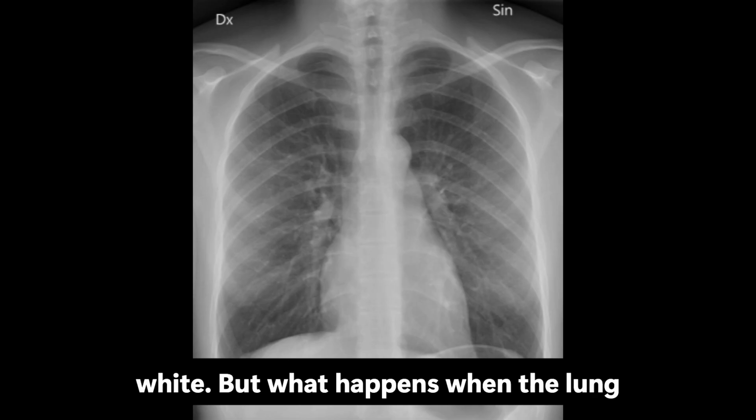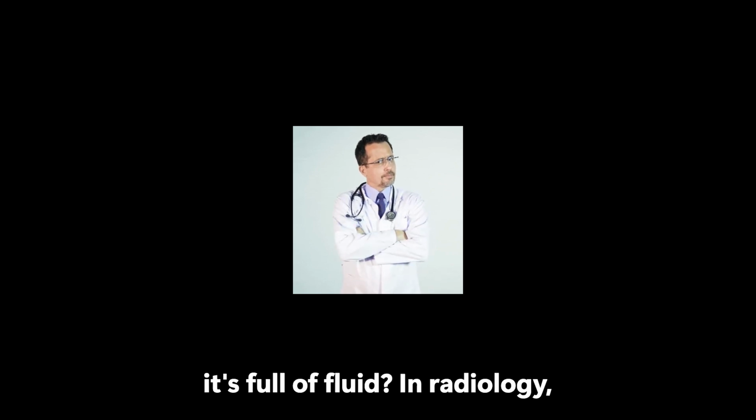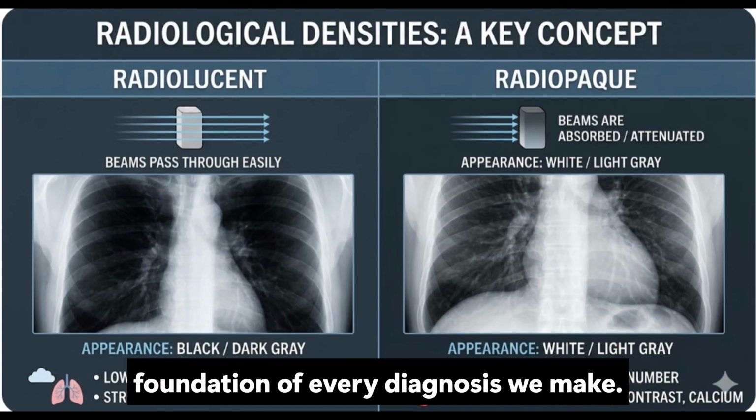But what happens when the lung isn't full of air? What if it's full of fluid? In radiology, we call this radiopacity. This contrast between black and white is the foundation of every diagnosis we make.